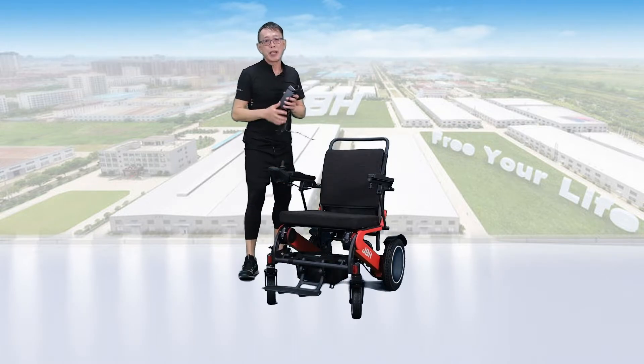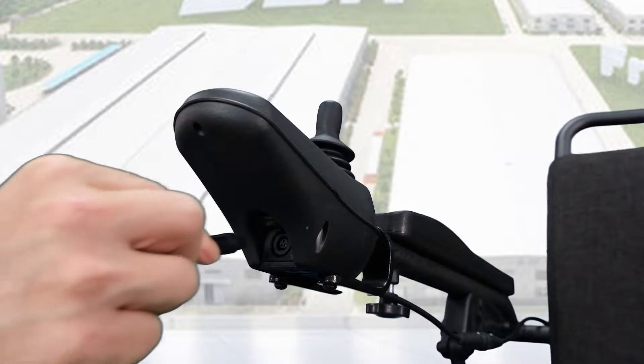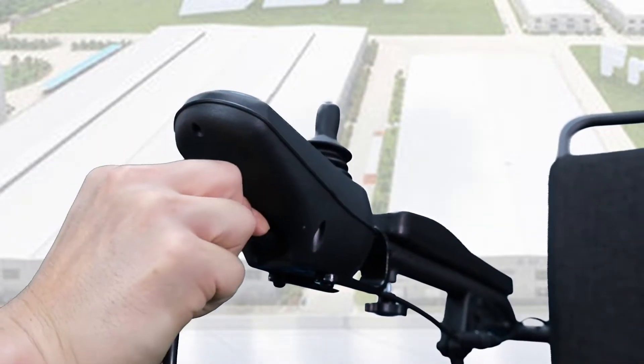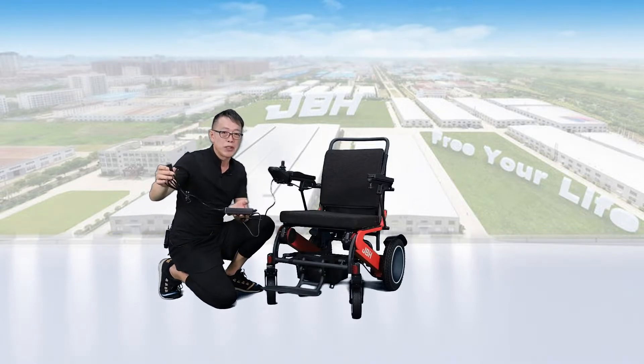There are two ways to charge the battery. First, you can do a direct charge from the controller — simply insert the plug here, then connect the charger plug to any power source to charge it.